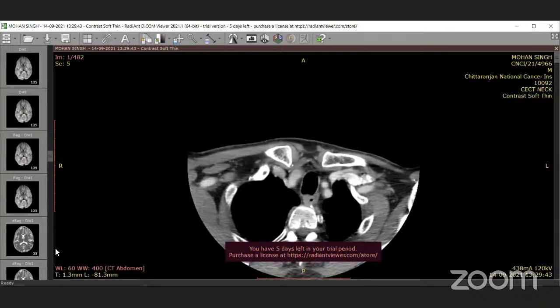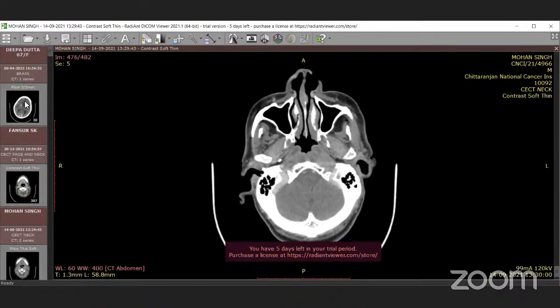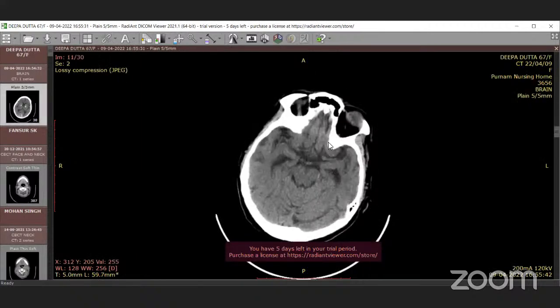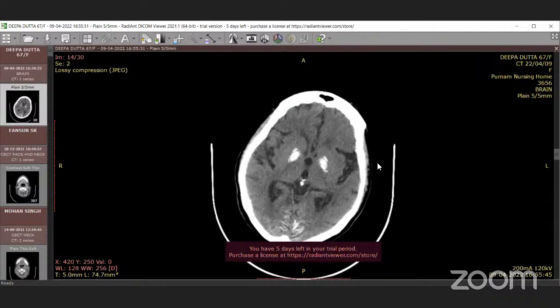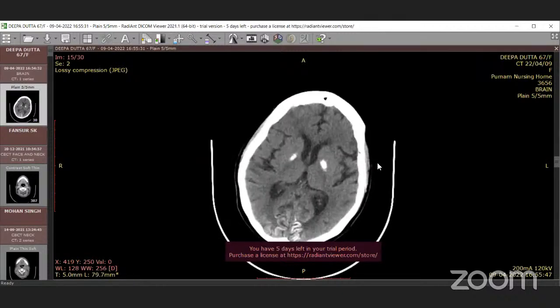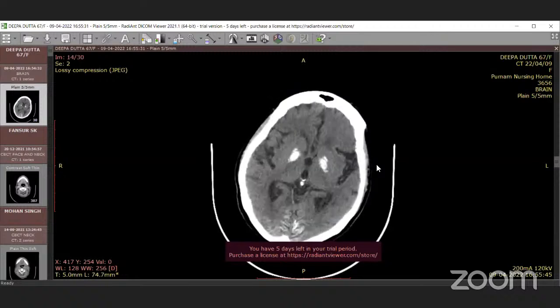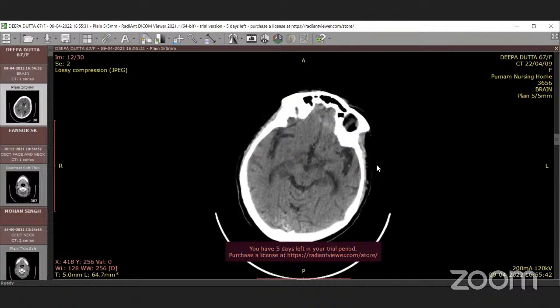I will take you through an MR because on a CT it will be very difficult. Is it possible on a CT? It is possible to do it on a CT. Yes, definitely. Ultimately, when we contour the temporal lobe, mainly we get a CT. Fusing the MRI and CT might be there, but sometimes the fusion is not that good. In those cases, we have to delineate on the CT scan only.